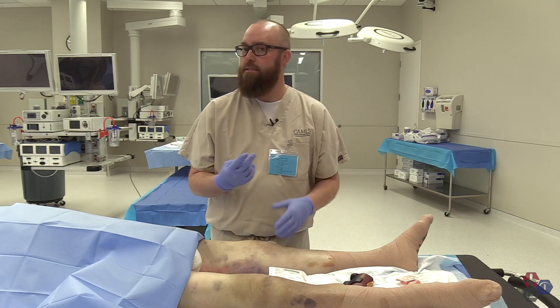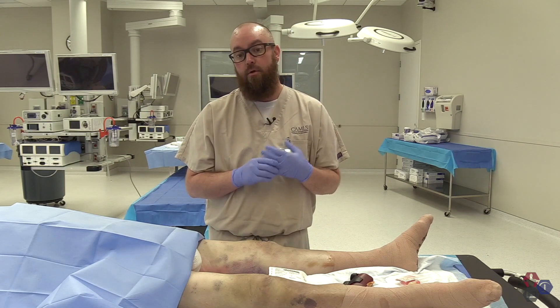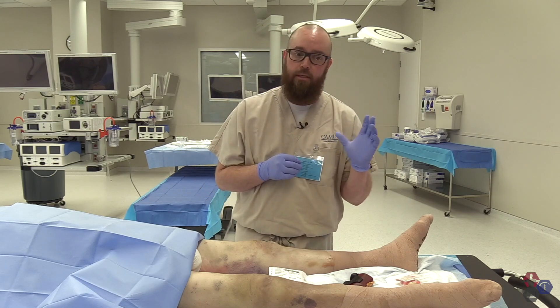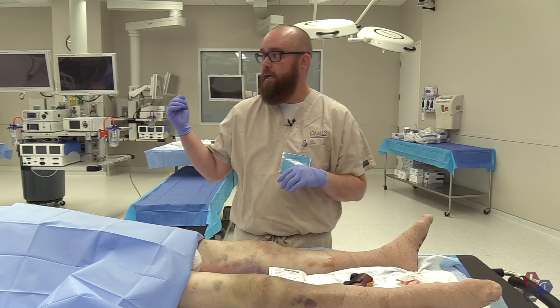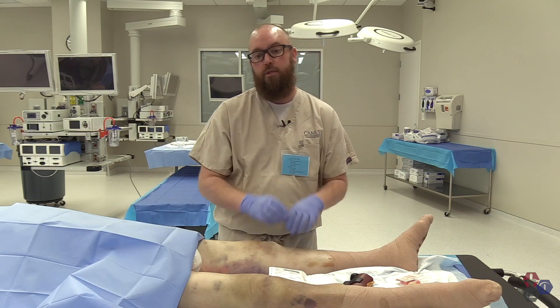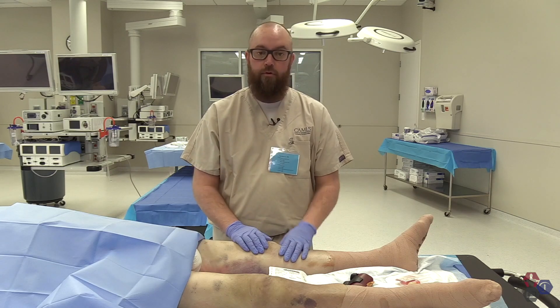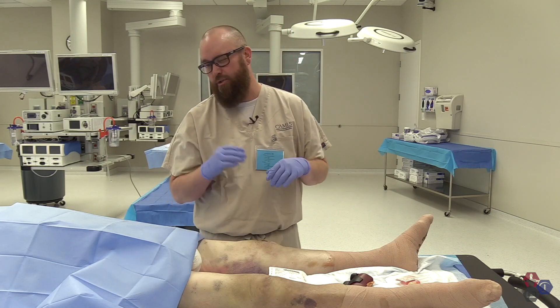The other two places where IO is used are the sternum — which, to my knowledge, hasn't really proliferated in civilian medical treatment — and the humerus, which is becoming more and more in favor because the complications are less.